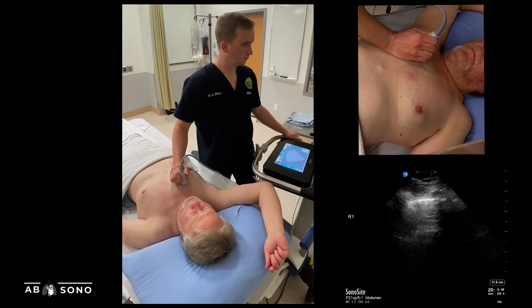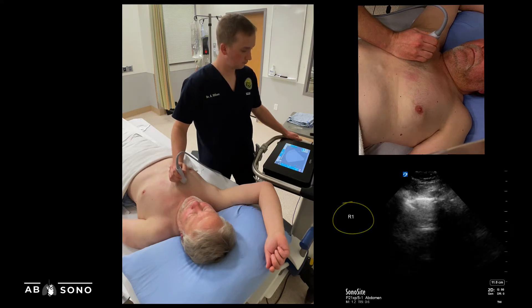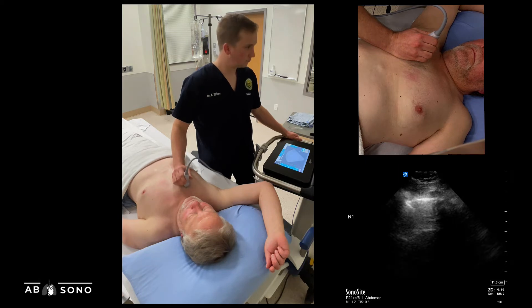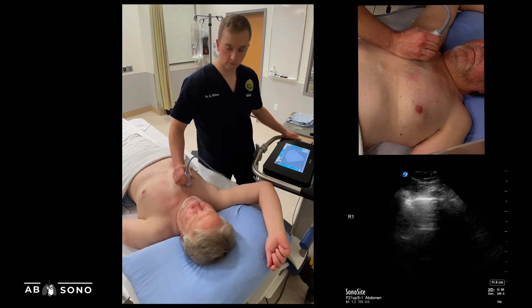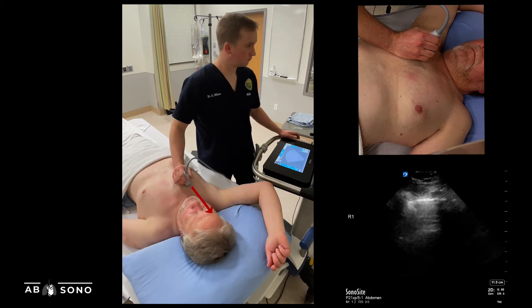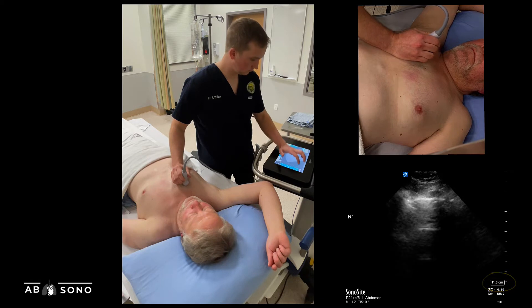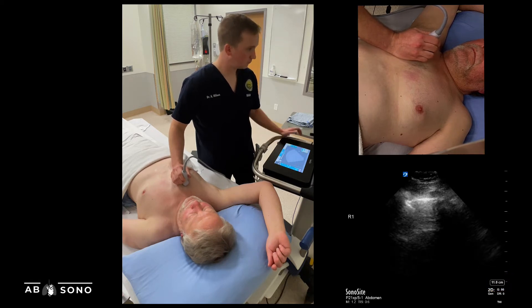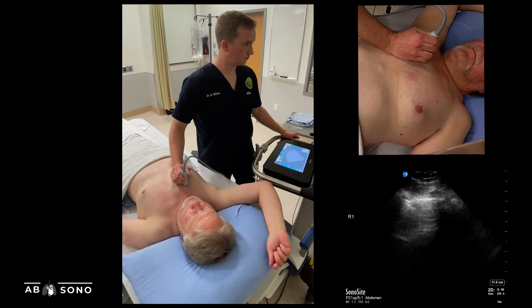The first zone is denoted R1 or L1, with letters R and L indicating laterality. This can be obtained by placing the probe at the second intercostal space in the mid-clavicular line, with the marker dot pointed towards the patient's head. The depth should be set at around 10 cm, adjusted for body habitus, with the aim to visualize both the pleural line and determine whether an A- or B-line pattern exists. Excessive depth will make pleural line assessment challenging and should be avoided.